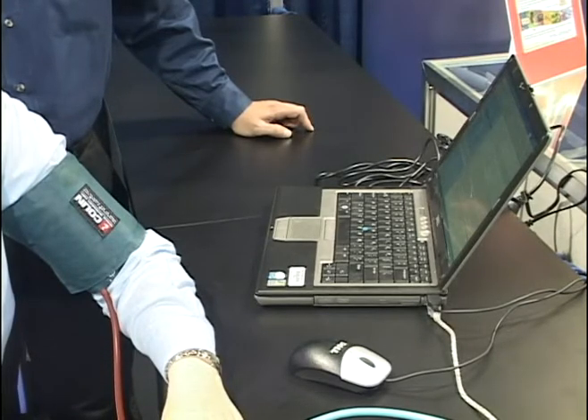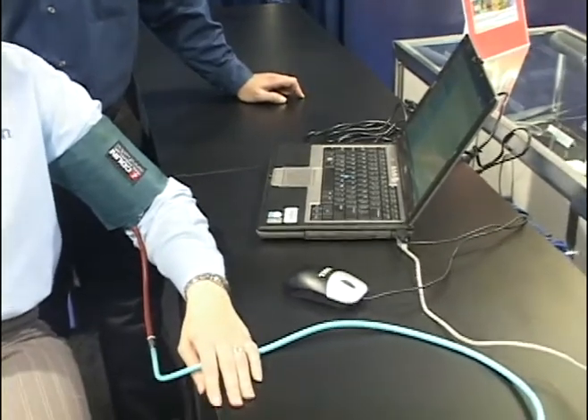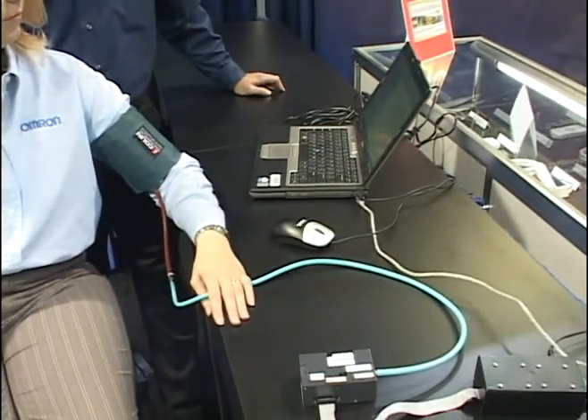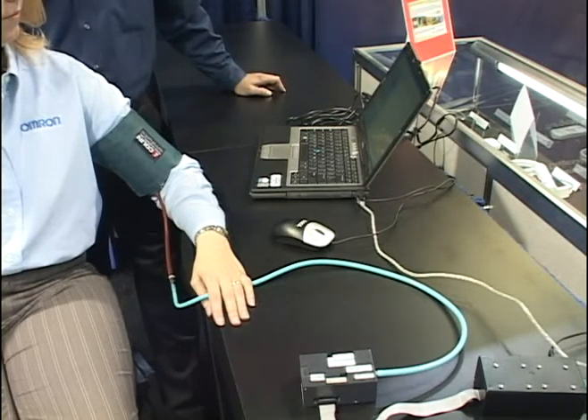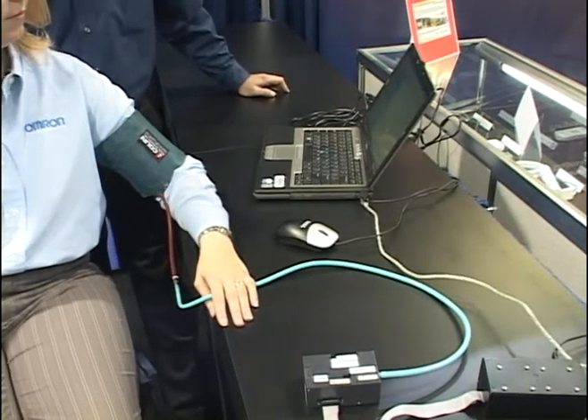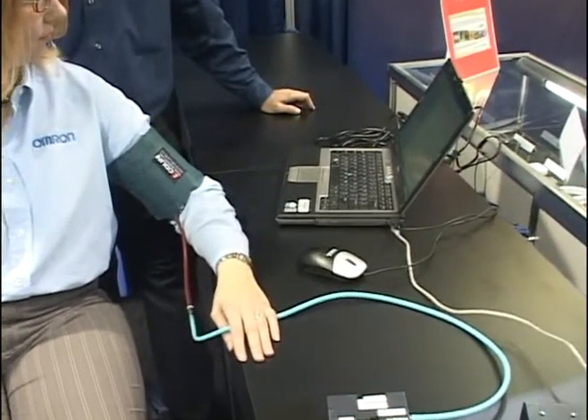The hose is connected to a standard blood pressure cuff. It will inflate to either a preset measurement — 180 millimeters of mercury, for example — or you can use any of our smart inflation technology, which will automatically determine arterial occlusion for the patient.